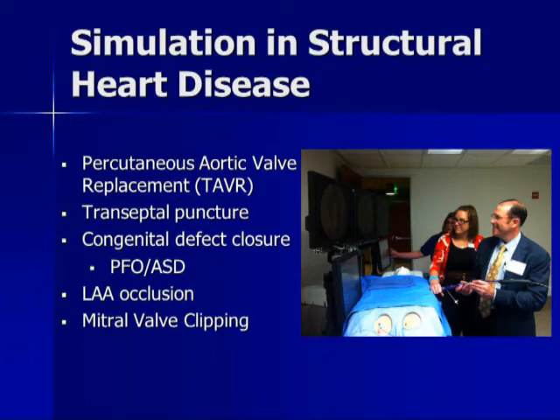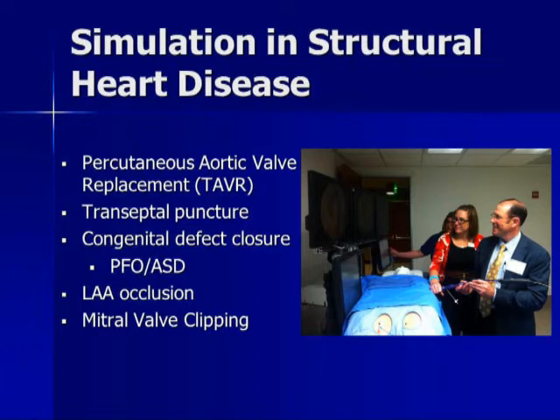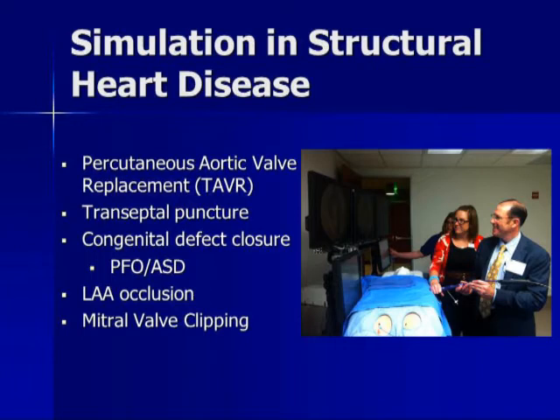Transeptal puncture, which allows us to go from the right side of the heart to the left side of the heart to work on valves, is something that all of my senior faculty did blindly with X-ray. We now do it with ultrasound, but it's a procedure that really wasn't needed. It fell out of favor for about 20 years and is now firing back up as our electrophysiologists work on the left side of the heart for treatment of atrial fibrillation. But it's a skill set, again, associated with major comorbid conditions in hospital complications, about 5 to 10%.